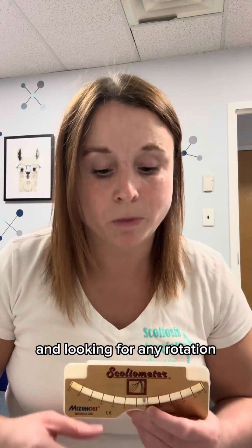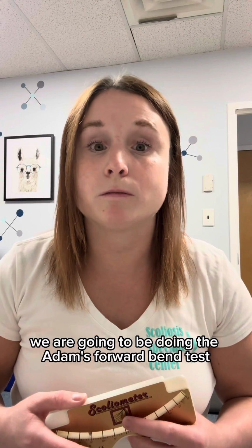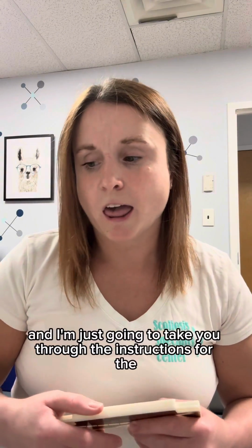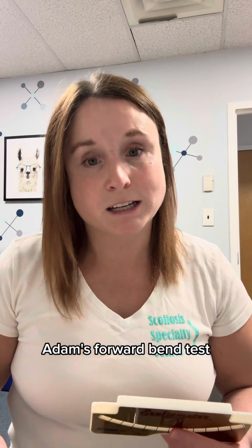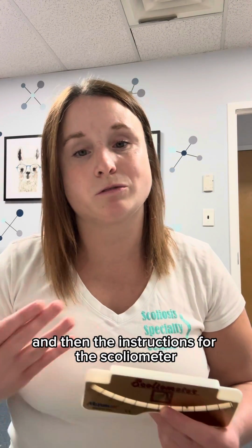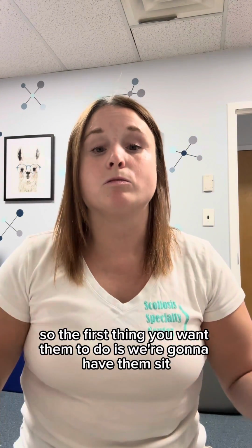But prior to doing the scoliometer measurement, we are going to be doing the Adams forward bend test. And I'm just going to take you through the instructions for the Adams forward bend test and then the instructions for the scoliometer. So the first thing you want them to do is we're going to have them sit.